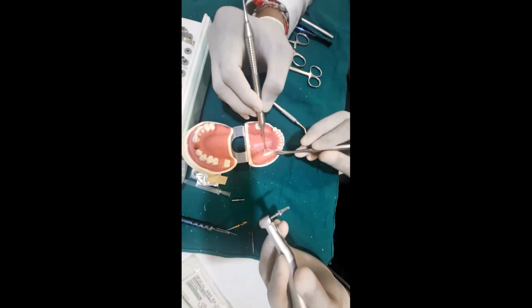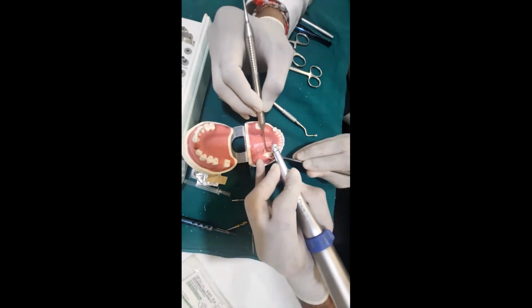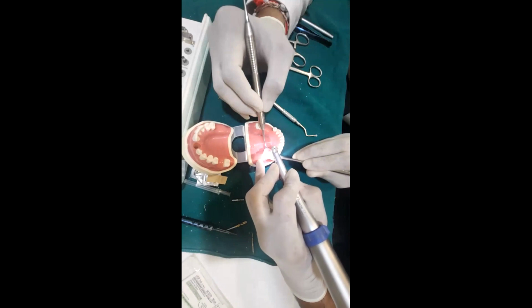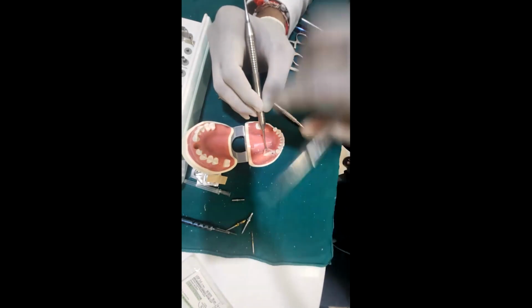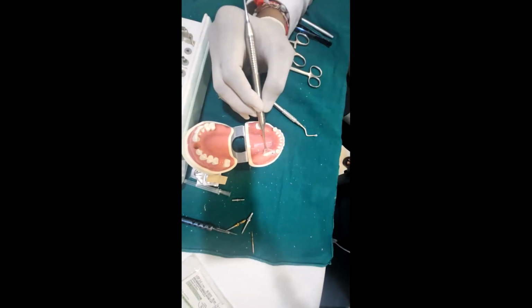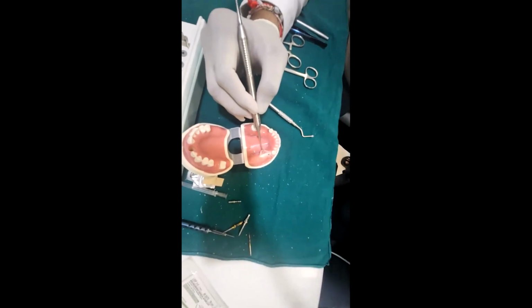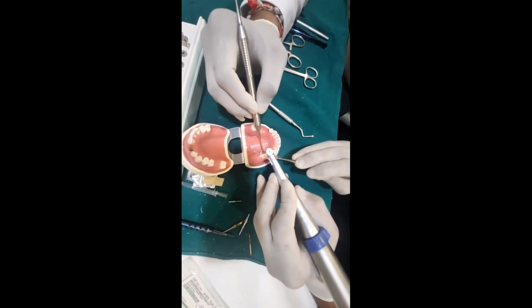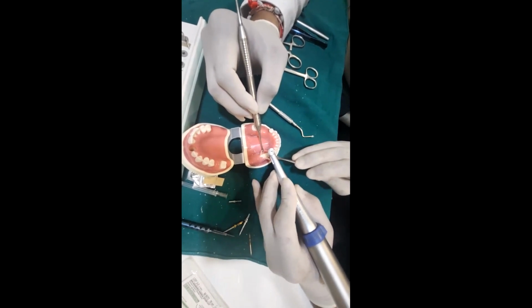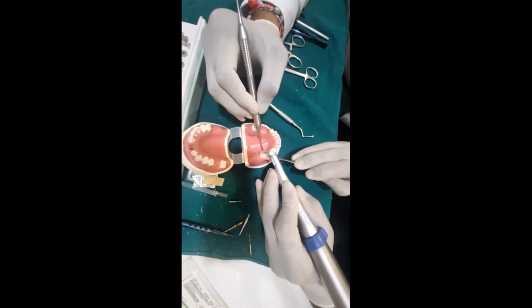My next drill will be the 3.5 by 10. And your final drill that you do should be only one in and out as far as possible. A clean one, and you can also reduce the speed if you feel that the bone is soft. If you feel that the bone is D1 type, then you can keep it at 1000 RPM. Otherwise, go at a low speed and you are out.